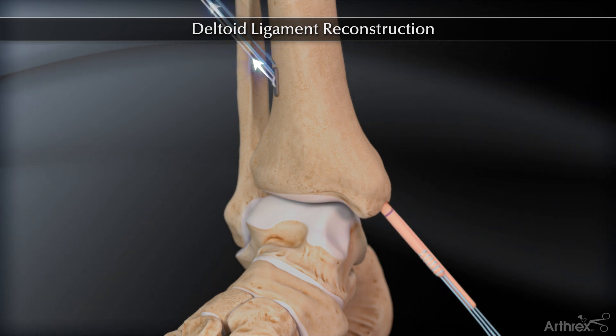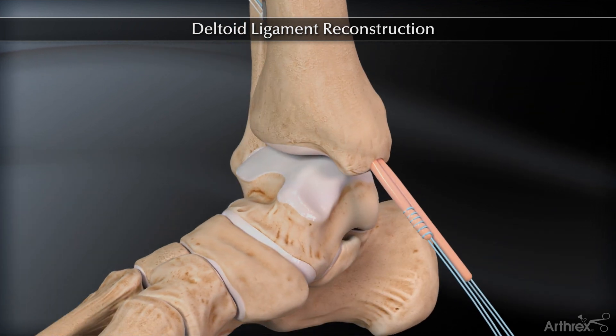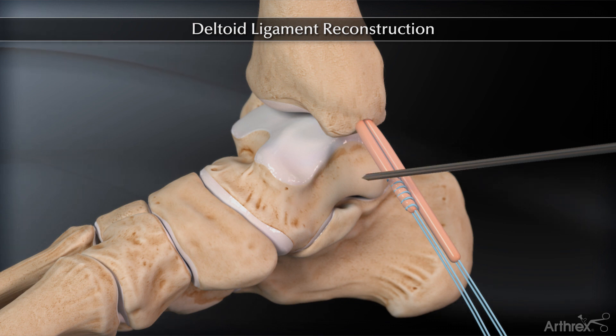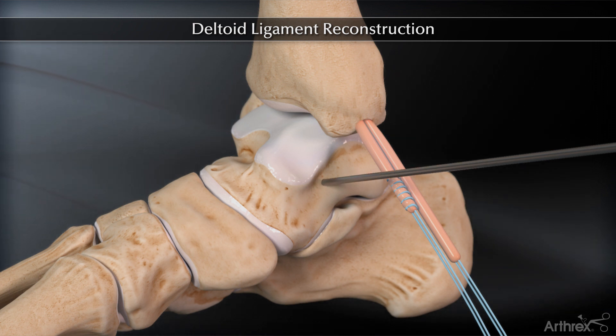Toggle the white sutures proximally to pull 15 mm of the graft loop into the tunnel. Aiming in a slight plantar direction, a guide pin is placed at the insertion site of the deep anterior tibial talar ligament. This is 1 cm posterior to the anterior corner of the medial talar trochlea, immediately inferior to the articular cartilage.